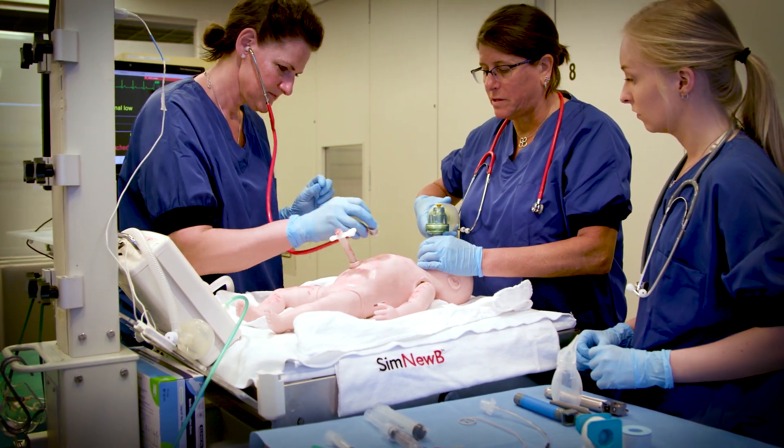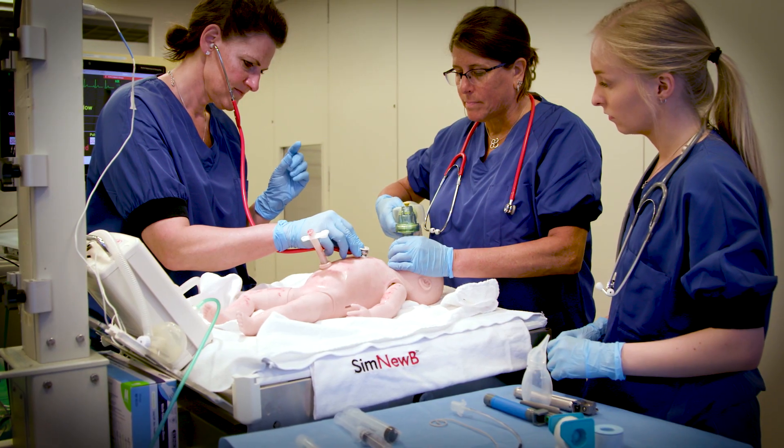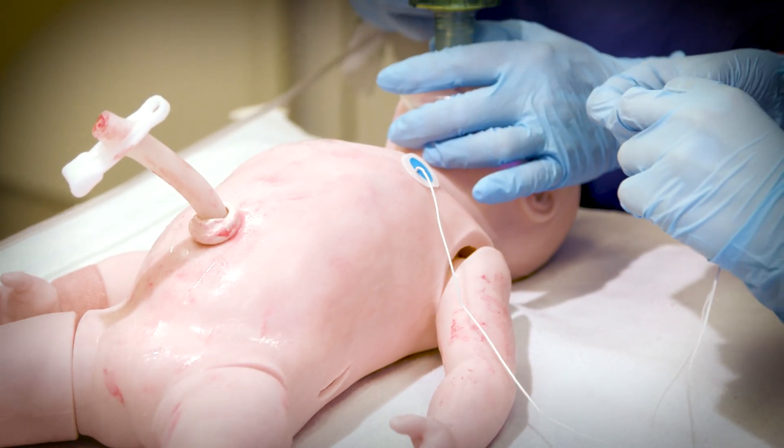Okay, let me ventilate for 15 seconds. We have chest rise. And then prepare for intubation.